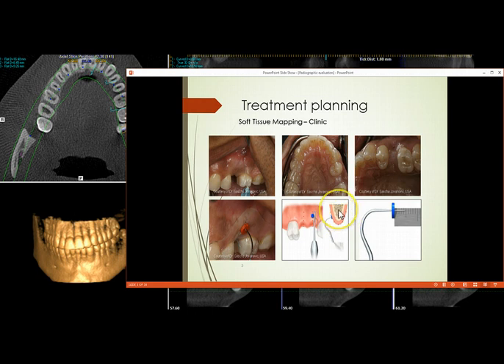All right. So this will conclude our radiographic evaluation. We discussed the phases, how radiographs are used in 3 phases in implantology. We talked about the radiation aspect, how much radiation each imaging type gives for periapical, for PA, for CT scan, and how it's compared to other modalities in medicine for radiation dosage.